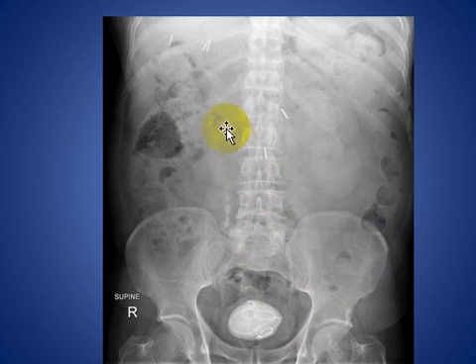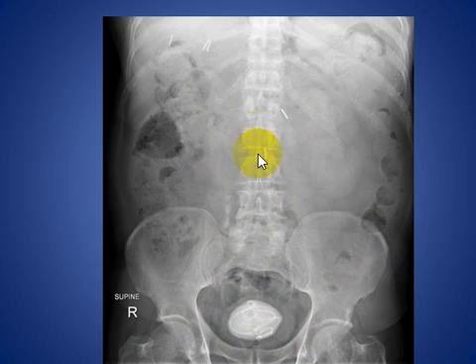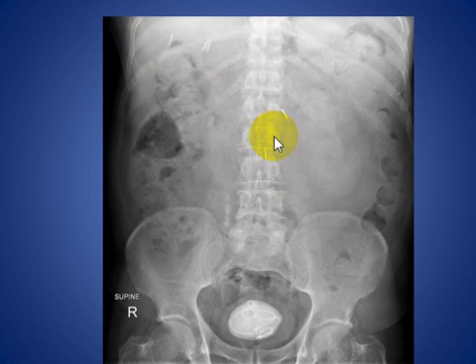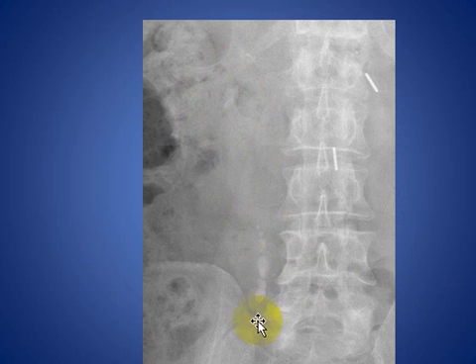Here you see two renal stones, and multiple ureteric stones are seen on the right mid-lower ureter, with a large stone in the urinary bladder. You also see surgical clips in the right upper abdomen and the midline of the abdomen. This is a magnified view showing the renal stones and multiple ureteric stones.